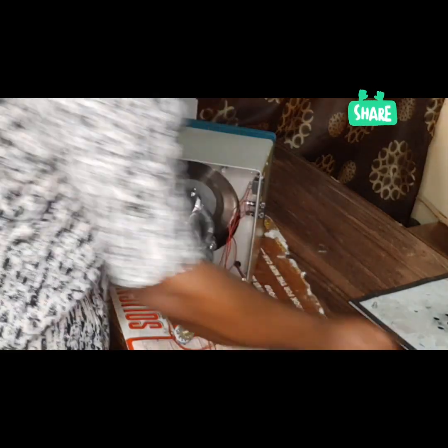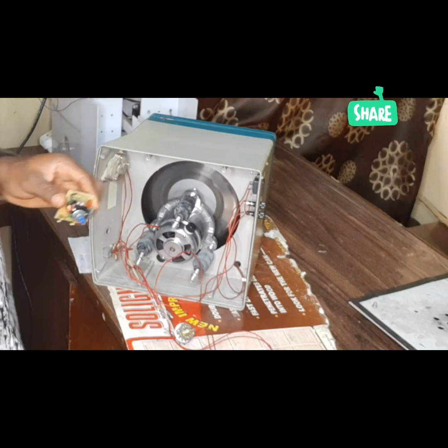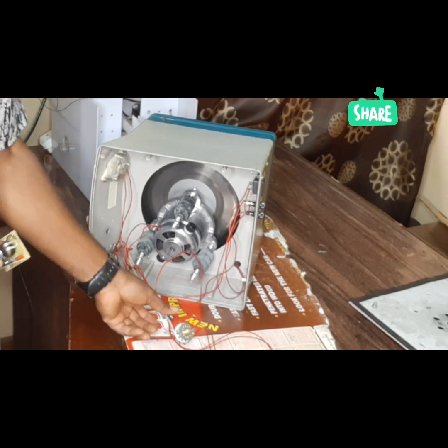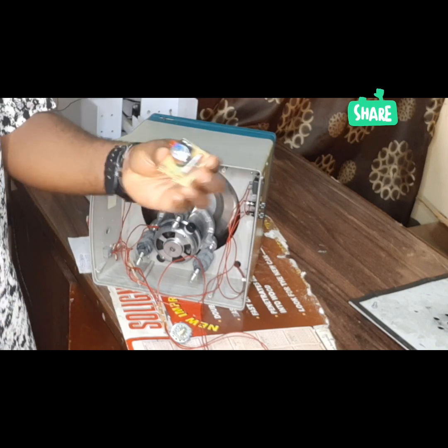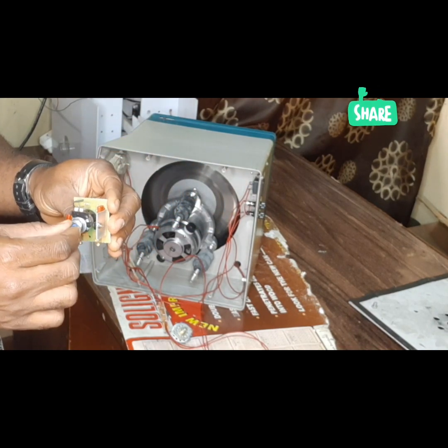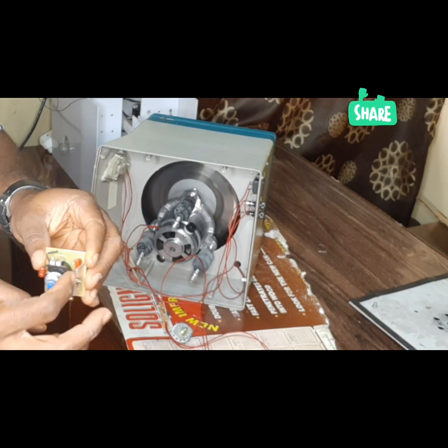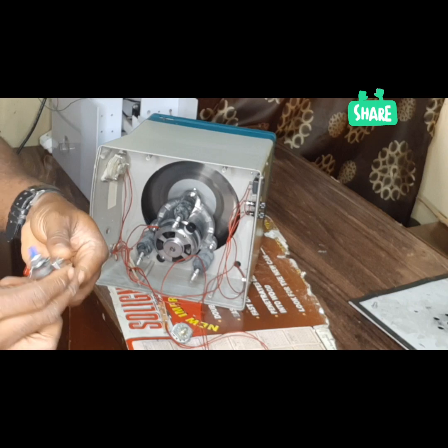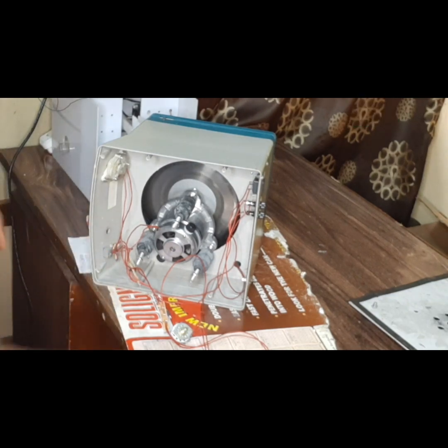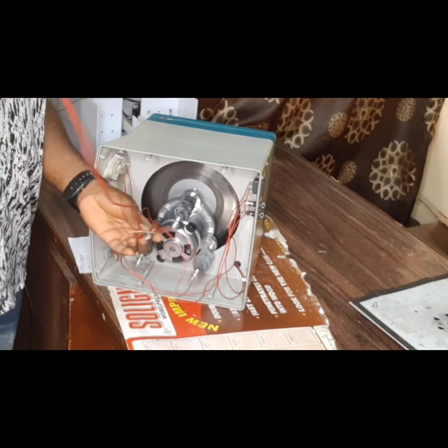So what I'm going to do is that I have another one here. I will quickly remove the entire regulator attached to this motor and introduce a new one. This very one here, you can see that the same potentiometer is there, and the semiconductors, the electronic part of it, is also attached to it. There are two terminals on this particular one. So let us quickly remove the whole of this.